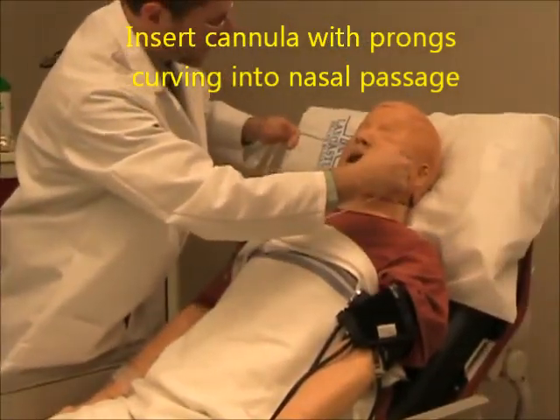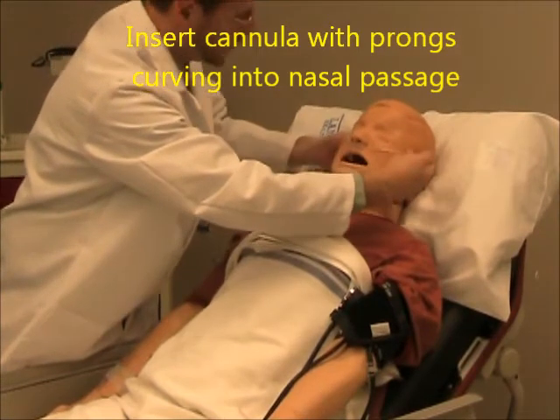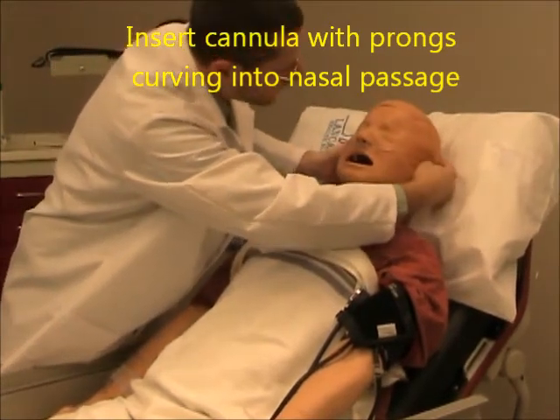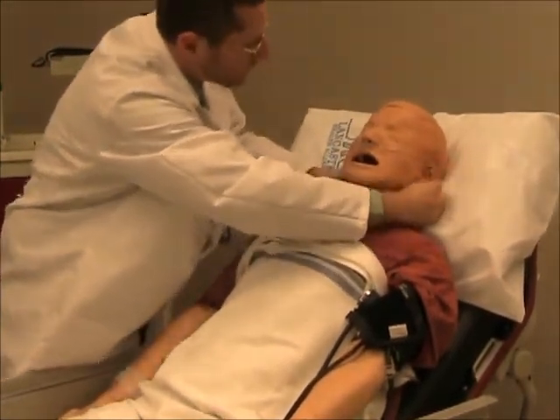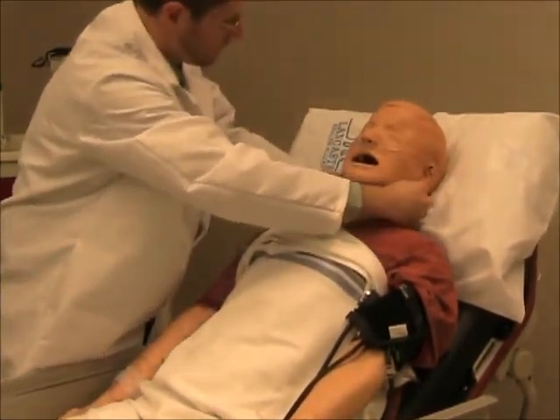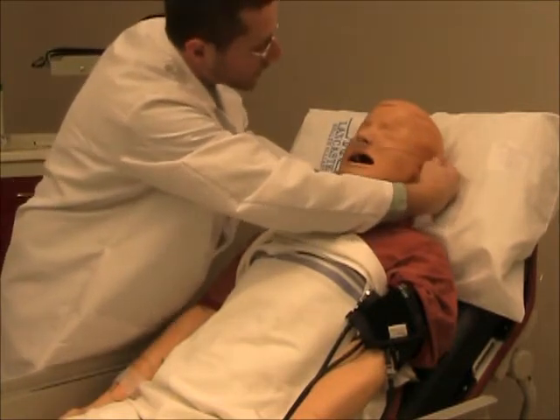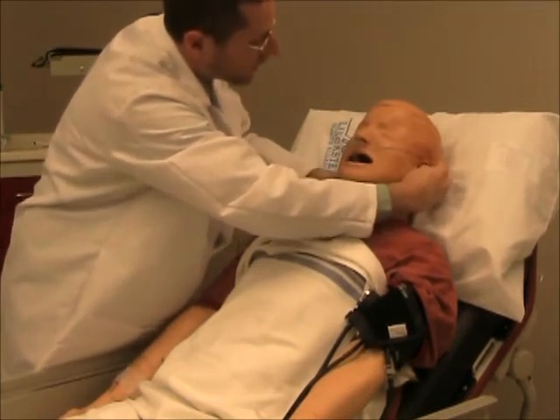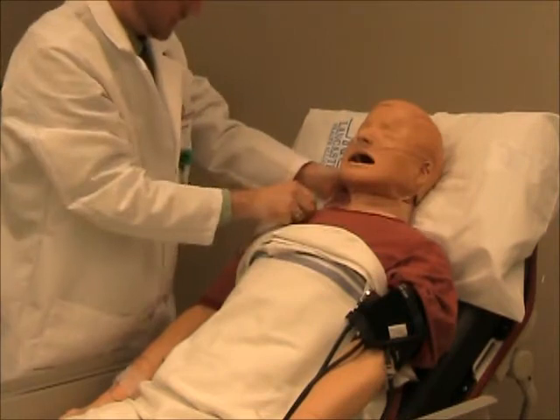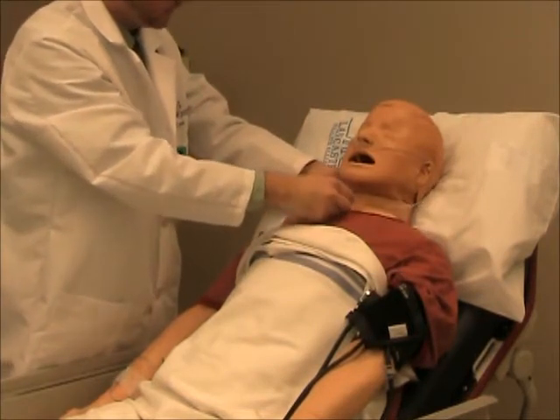Okay, so this is going to go in your nose and around your ears. Tighten up on your ear, there we go. And we're just going to tighten it under your chin.